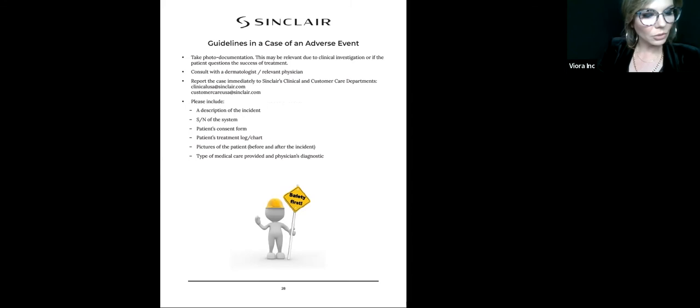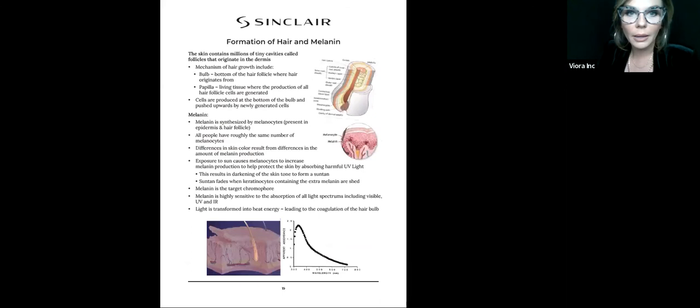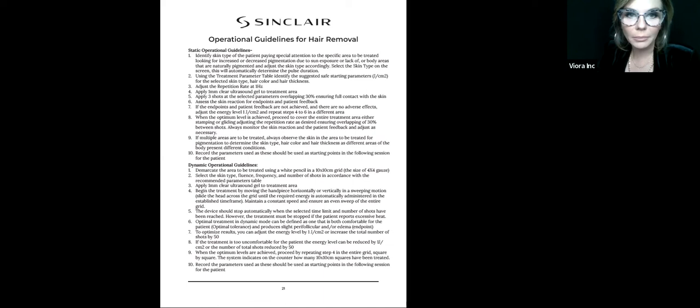So since I have a couple minutes, I didn't want to go over an hour on this webinar, but since I have time, I'm going to talk about a few things. I don't know if it's on here, but I'll just leave this page up just in case. If somebody has moles in the area, avoid moles. It's just a precaution, in case there's any type of cancerous cells in the mole and we're taking heat over it. Also to protect you as an owner operator.